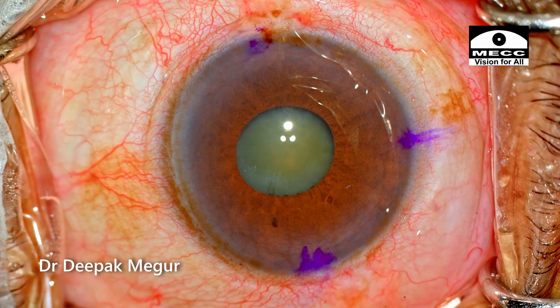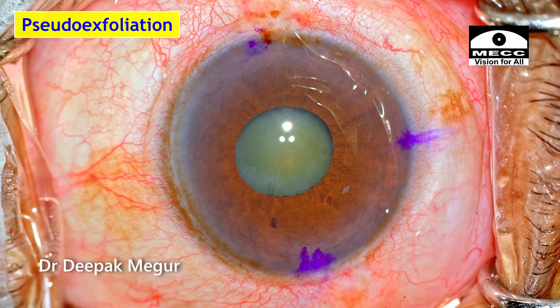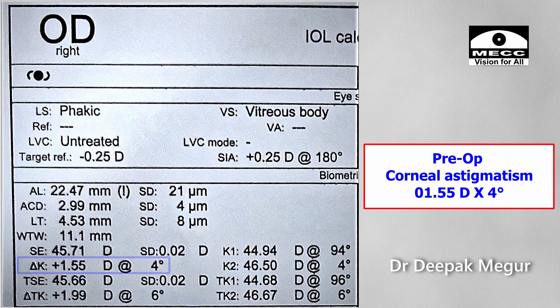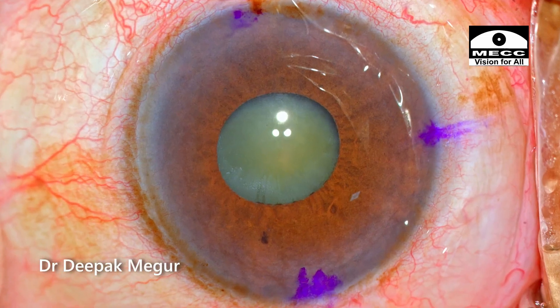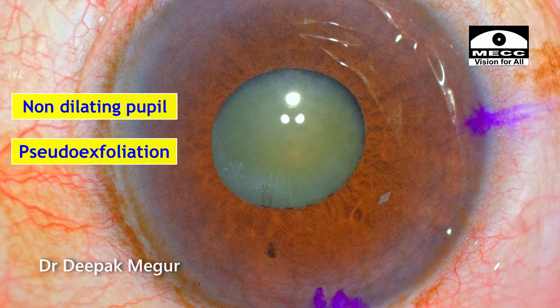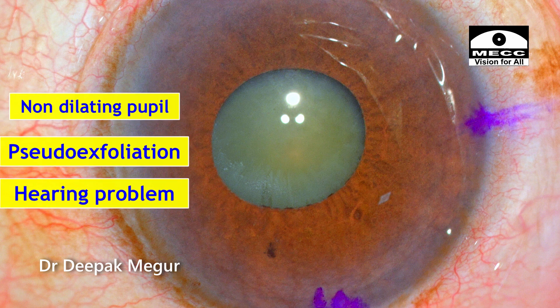Today we have an interesting case. She is a 75-year-old elderly lady who has pseudoexfoliation, a non-dilating pupil, and is posted for cataract surgery. She has a pre-existing astigmatism of 1.5 diopters which is against the rule and deserved an astigmatic correction. So a toric lens was planned, but there are a couple of challenges — apart from the non-dilating pupil and pseudoexfoliation, the elderly lady has extreme difficulty in hearing. That was actually more concerning for me.